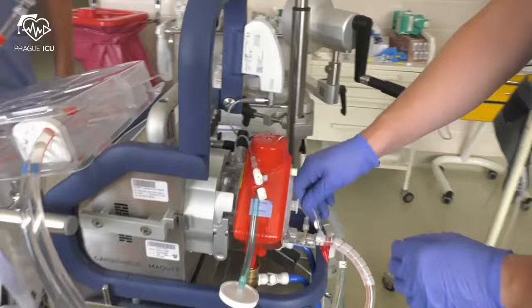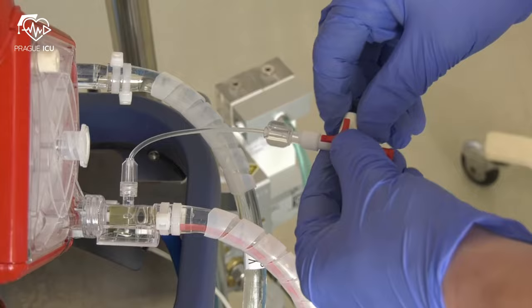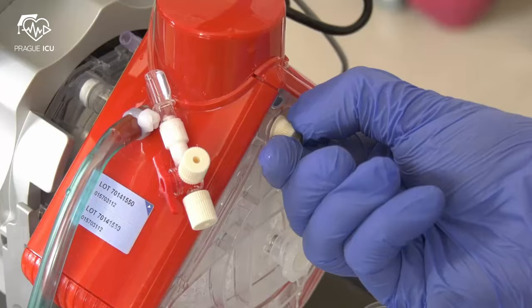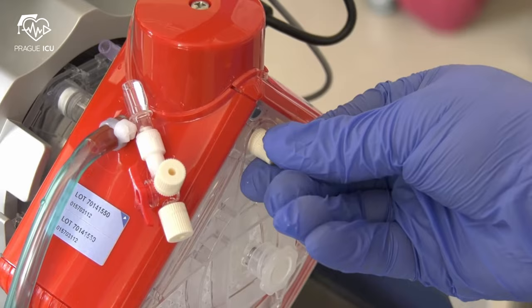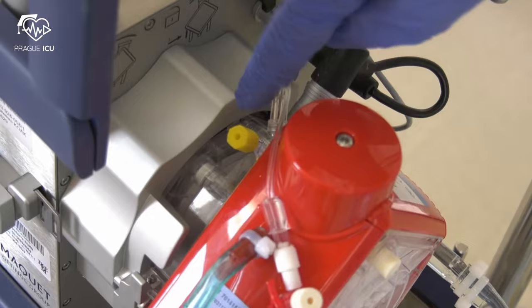De-air the lower luer-lock connectors before and behind the oxygenator. Make sure that the entire set is de-aired. Close the de-airing membrane with the yellow cap.